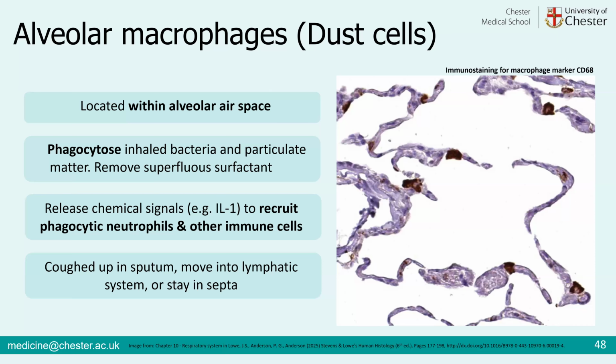a thing that alveolar macrophages engulf a lot of is carbon particles, from exhaust fumes, for example, from cigarette smoke. And if they're overwhelmed, if they've engulfed loads of these harmful carbon particles, that damages their function and they can't move anymore. They're not motile and they end up getting stuck in the septa of the alveoli. And because we said they're important for directing immune response, that can cause prolonged inflammation, which can cause fibrosis and scarring and reduction of lung function.